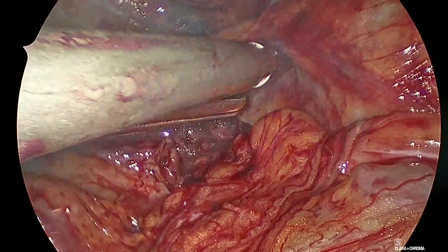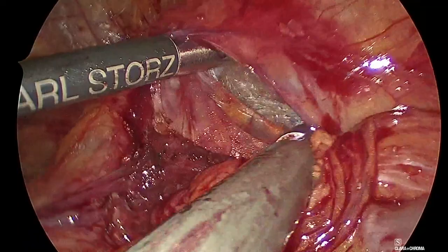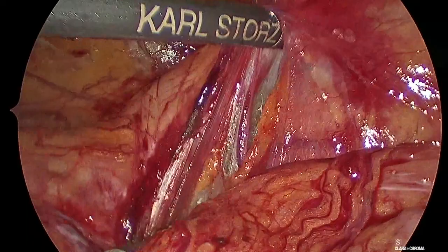There you go. So little by little, there's a little bit of inflammation, but the plane is separating nicely. And we want to get to the psoas muscle. So the ureter, we are elevating the ureter. Okay. There's a vessel in here.